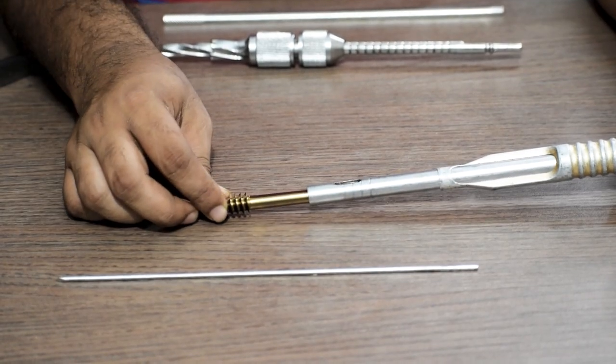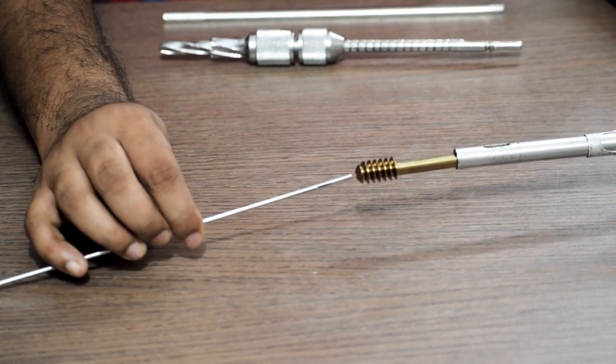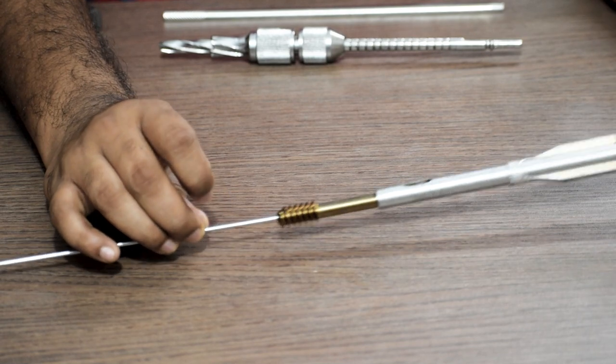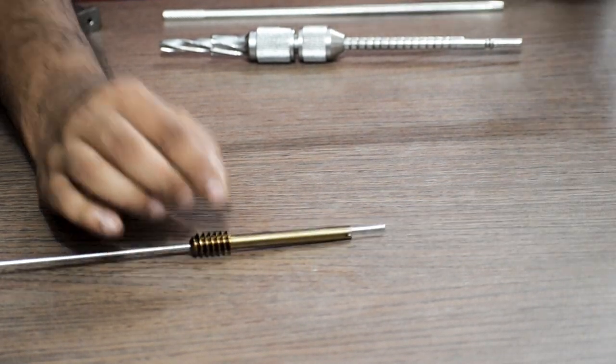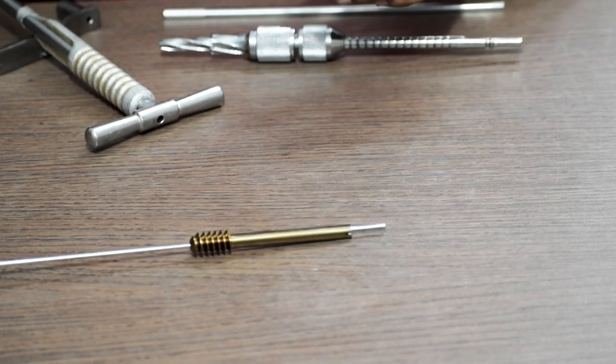Once the lag screw is attached, we insert the lag screw through the guide wire and then remove the T-handle. The lag screw stays inside.